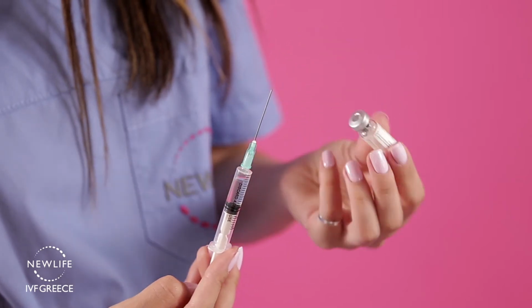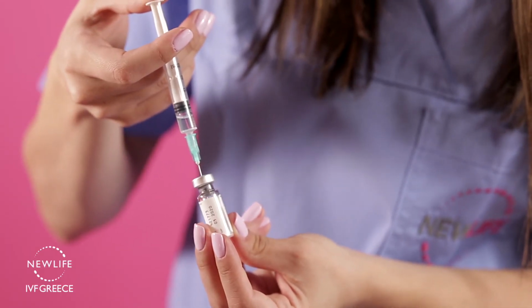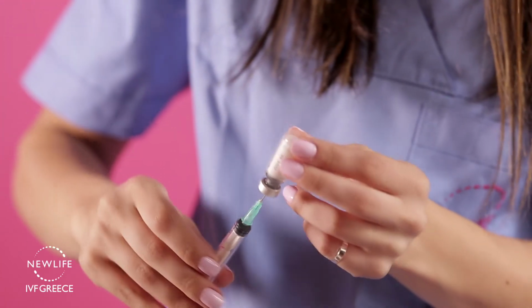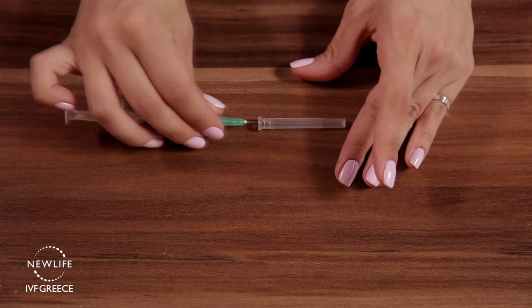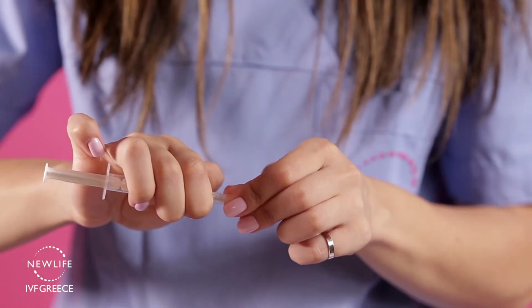Take the second vial of powder, remove its protective cap, take the syringe filled with the solution, and repeat the process. Now you will have inside the syringe the solution of 2 vials of powder and 1 ampule of solvent. Recap the mixing needle and remove it.